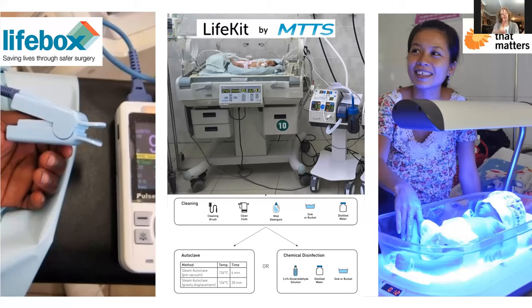And infants were often given for breastfeeding and brought back to maybe a different bed. So there's a lot of sharing and potential for cross-contamination with just the bedding itself. So even thinking about how we would design a better phototherapy device for a low resource setting, where there's not a lot of opportunity for laundry and it's a low staff to patient ratio, this particular bed is completely smooth, and the idea is around making something really wipeable and cleanable.